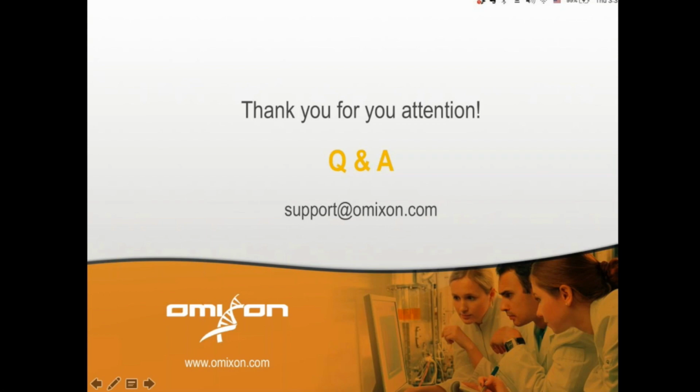So another server-related one. It looks like there are a lot of server-related ones. Will my lab need both a typing and reporter server? That's actually a very commonly asked question. Yeah, I have heard this question a couple of times before. I think that you are asking whether you need two physical machines, one that is dedicated to typing server and one that is dedicated to the reporter server.